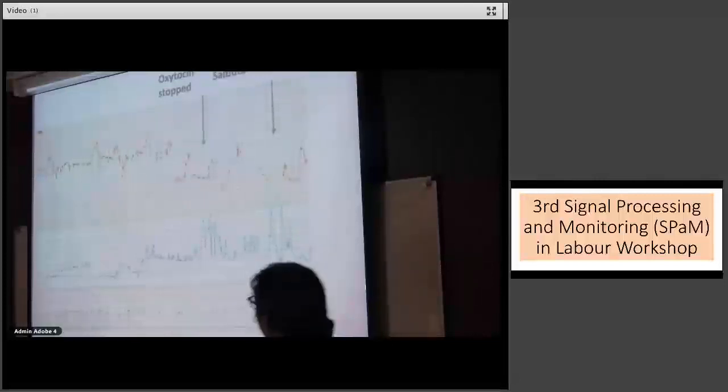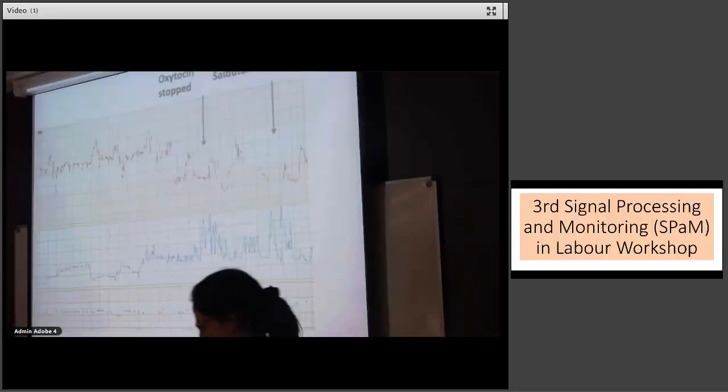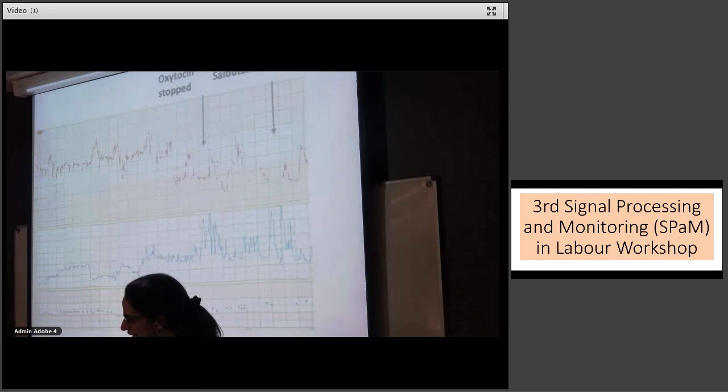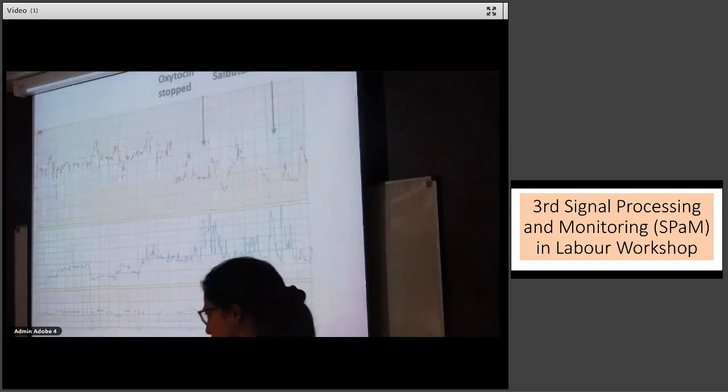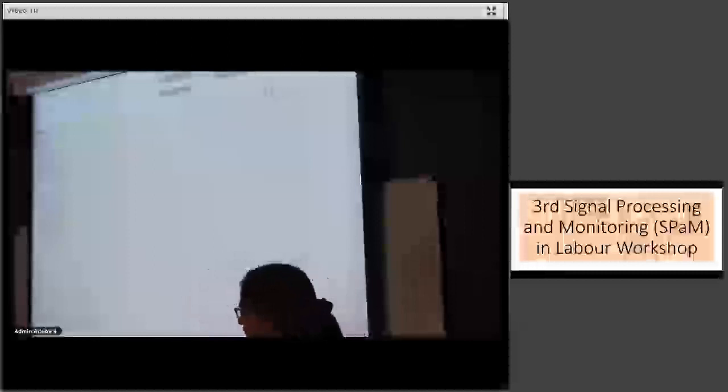Consider the effect of having her push to outrace this fetal distress. Not only are you not going to outrace it, but you are going to increase the pressure in the head and limit the amount of perfusion in the fetal brain. So this pushing, rushing in response to the terminal deceleration, is counterproductive.